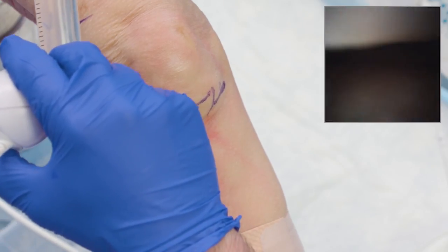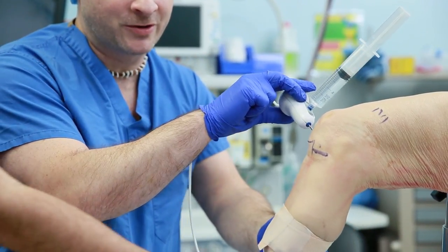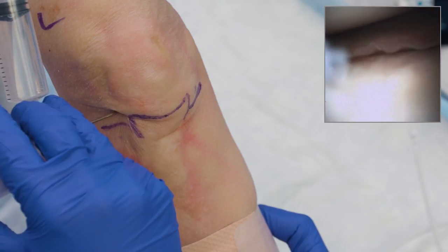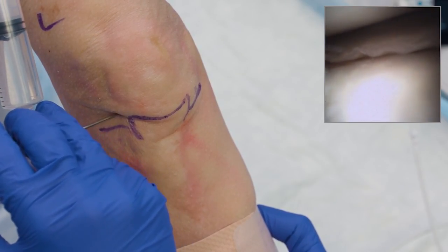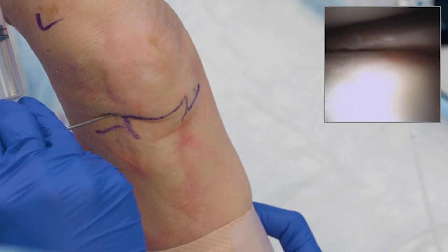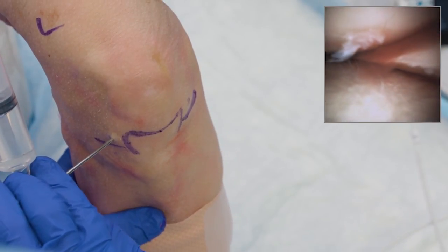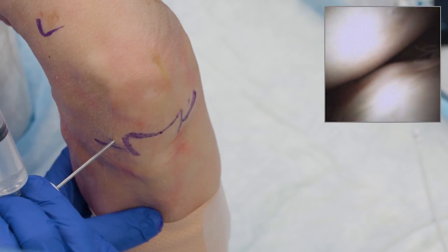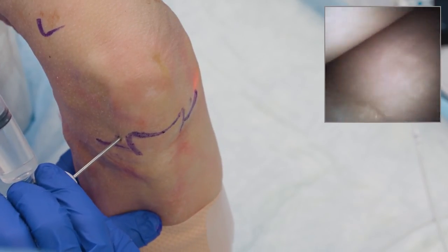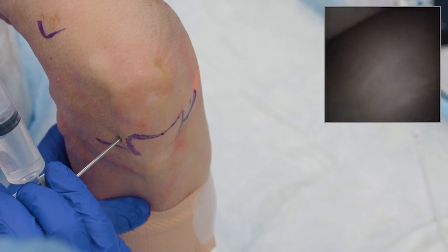I can extend back and see my posterior horn. When getting around to the posterior horn of the medial meniscus, I'll extend the leg to help sweep underneath — you can do this yourself or with an assistant. A gentle flush makes the meniscus flutter a little so you can see, and gets cartilage out of your face if there are degenerative changes. As I back out, I evaluate the leg from extension down to flexion, looking at the cartilage — there I'll see a chondral defect. I can then sneak just above the meniscus into the medial gutter, flex and extend the leg, and check for signs of a loose body hiding back in those recesses. Hyper-extension or hyper-flexion can help expose the posterior gutter.